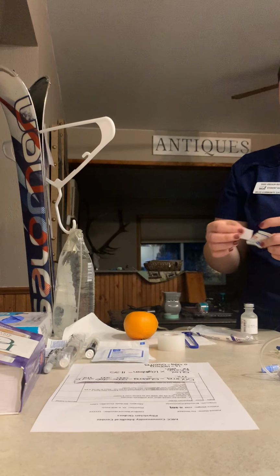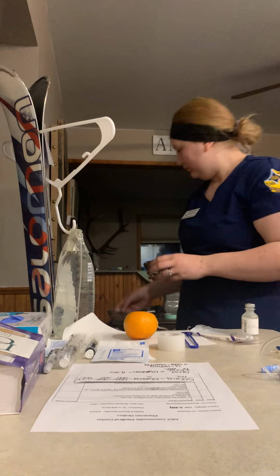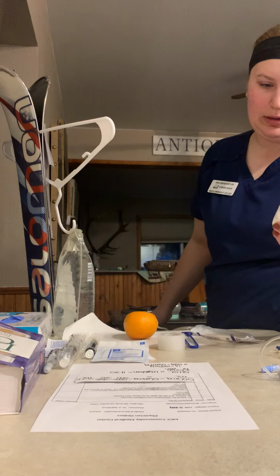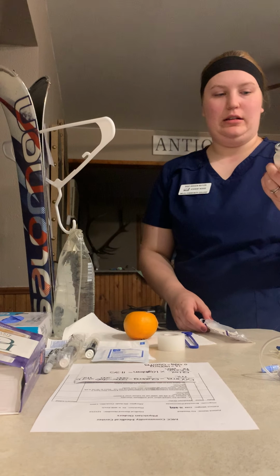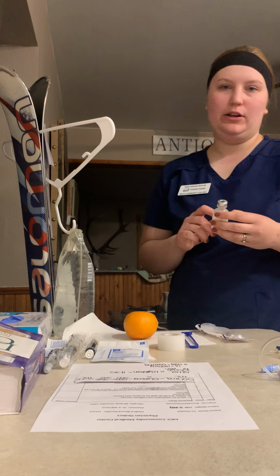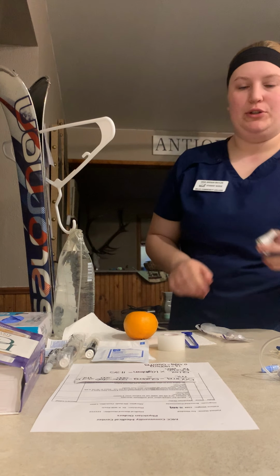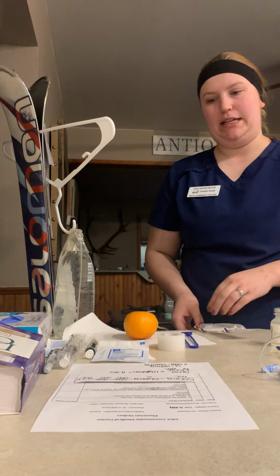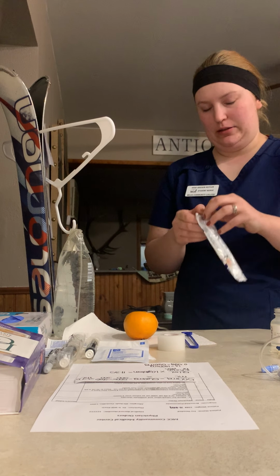I'm gonna wipe this off. And just double check with that MAR, make sure I've got the right med, and checking your vial too. If it is single use, you don't have to worry about labeling it or anything, but if it was a multi-dose, making sure time, date, initials, and then the date from now that it is good by.